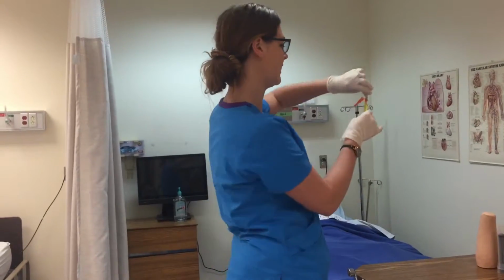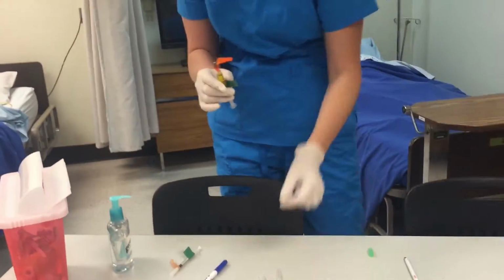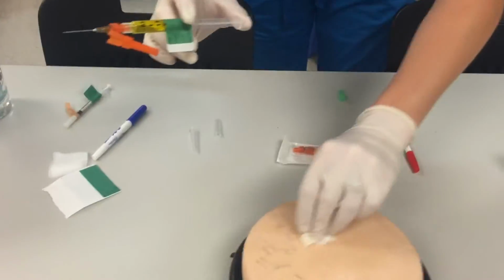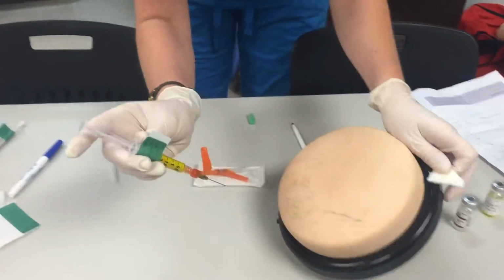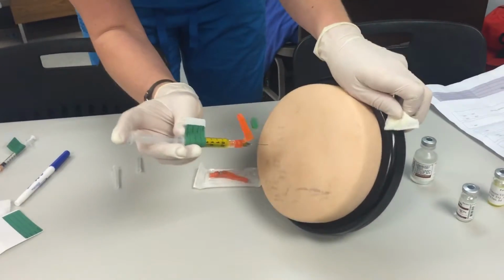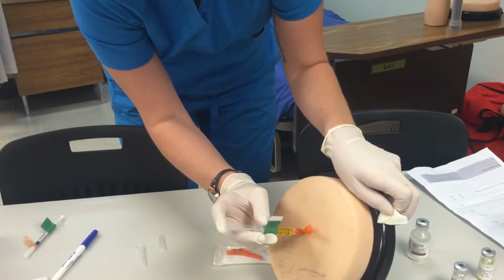This is the proper medication. I'm gonna open it away from my patient. And then, let's see. Okay, it's cleaned. This is kind of hard to do and show. But I would be about 2 inches away, put it in like a dart.